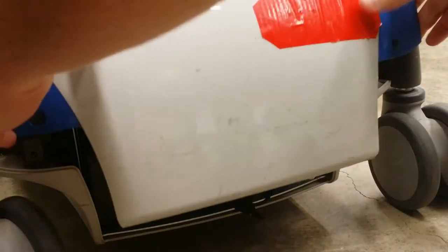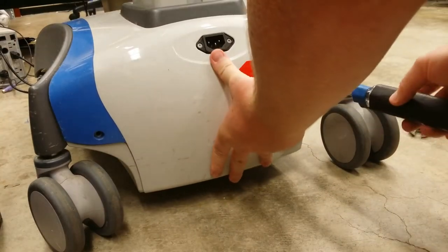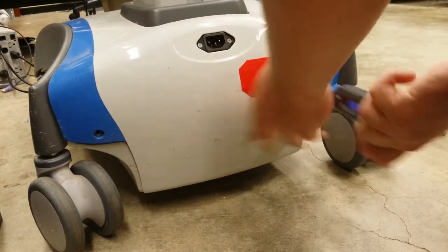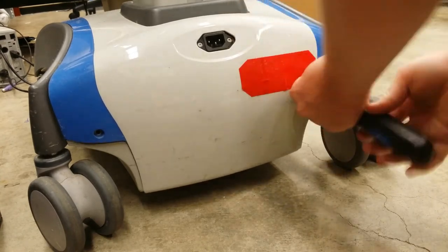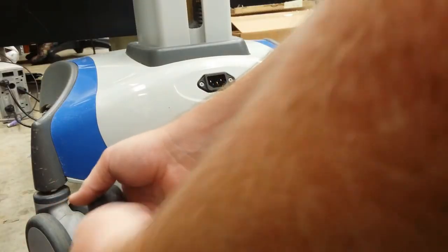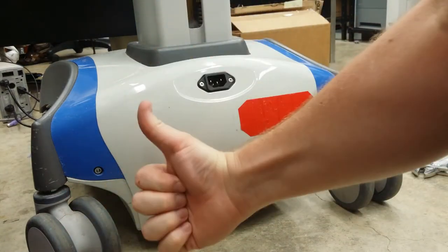Reinstall the rear cover and reinstall the two screws. That's it, you're all done.